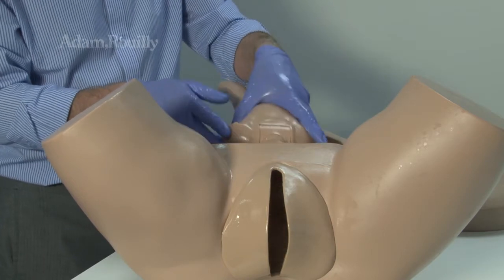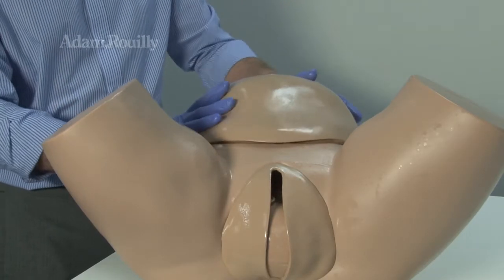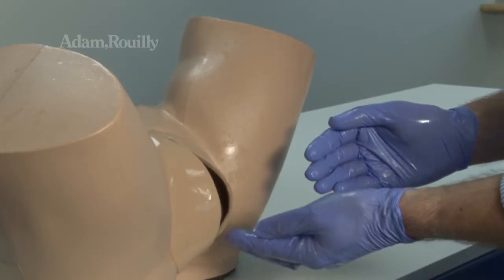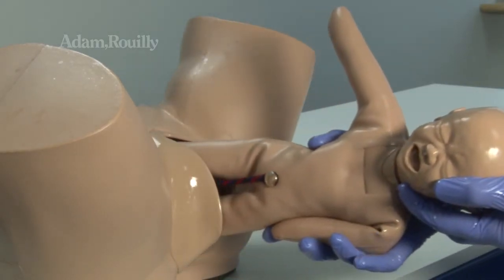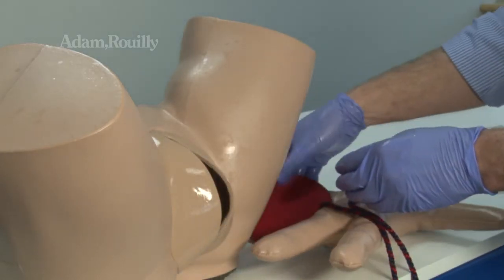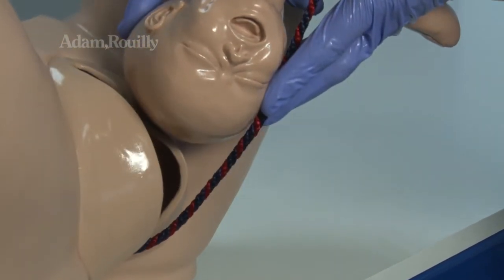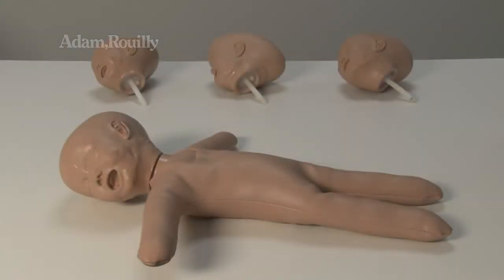Place the placenta before the foetal doll into the model. After replacing the cover, abdominal palpation is possible. Normal and breech delivery may be simulated. The included AR55 foetal doll has four interchangeable head presentations which can also be used with the phantom.